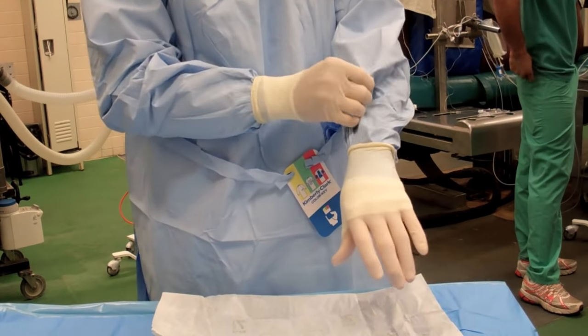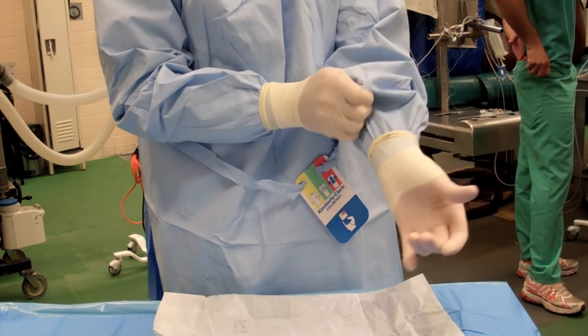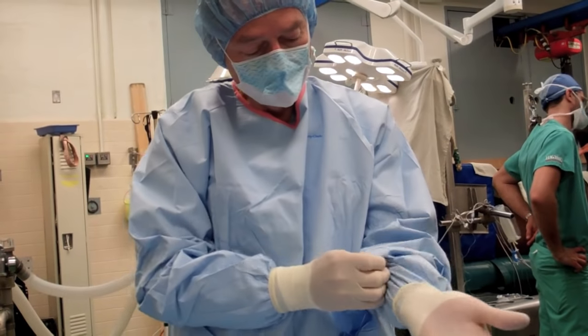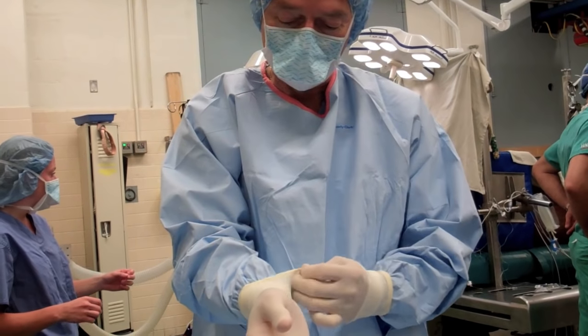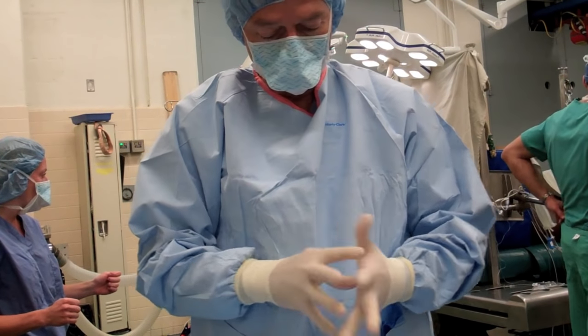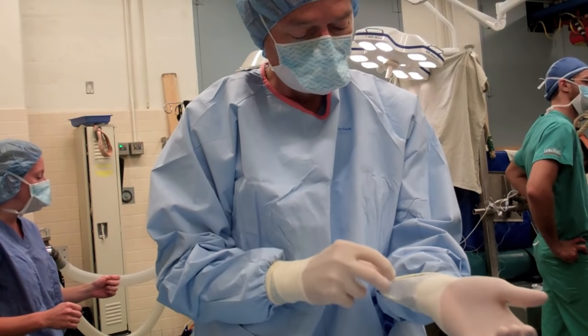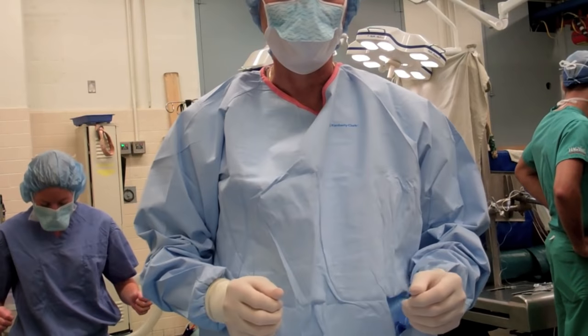That's the closed gloving technique — the technique we use most commonly here at New Bolton Center. Obviously it requires a gown and a sterile field to complete, unlike open gloving. Since some surgeries are long, you want to make sure that you have the proper size glove and that your gloves fit and are adjusted properly.